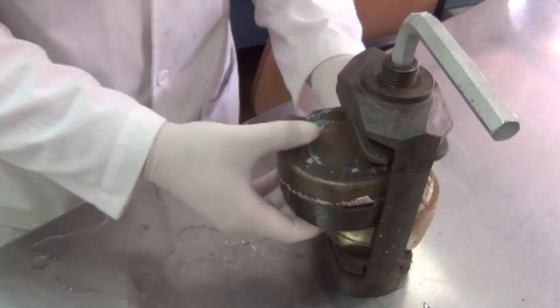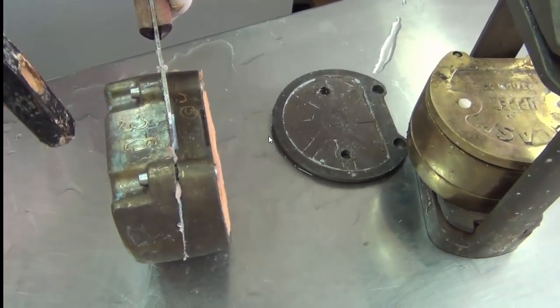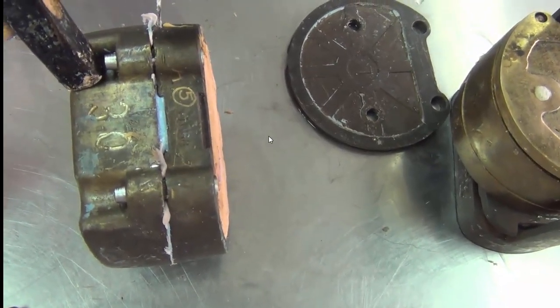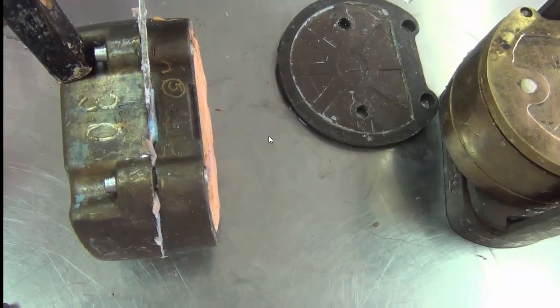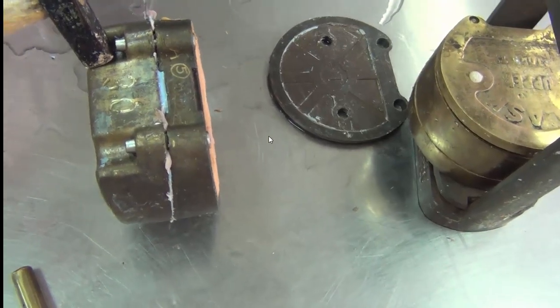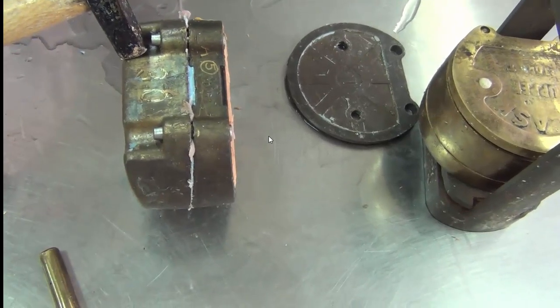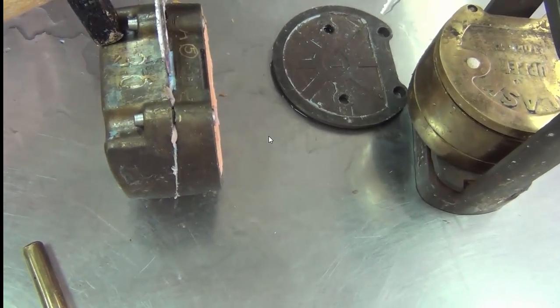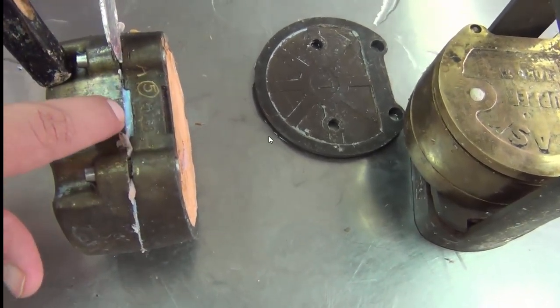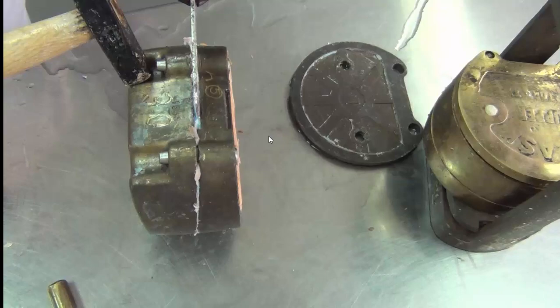Now, because we had used the separator, these members should be going out easily. But please notice the location where we had put the plaster knife, do you see this chamber? This is where a plaster knife should be put between the members. If we put the plaster knife in between the layers on the side, we will ruin the metal under the pressure of the hammering. So we want to make sure that we don't ruin the metal-to-metal contact on the other sides of the flask. So the flask is designed to have chambers. You have a chamber here to separate the lid, and you have a chamber here to separate the middle part, and you will see that we also have on the lower lid another place to separate it.